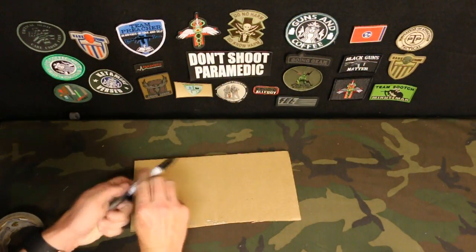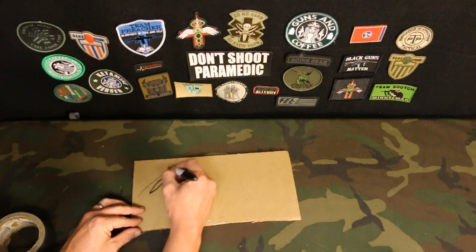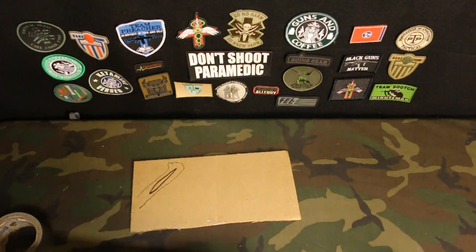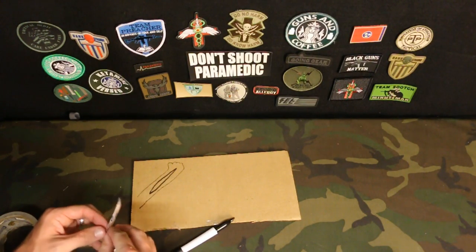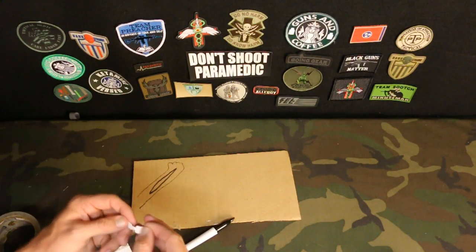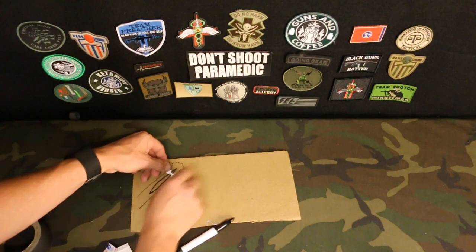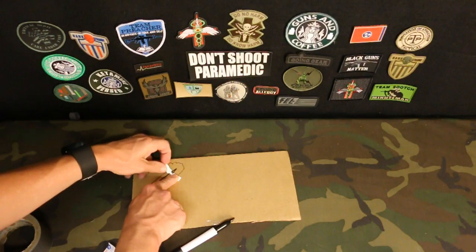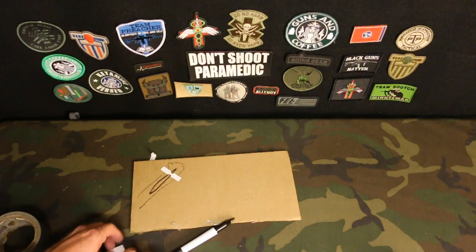Alright, so let's draw us another little cut here. I got a cut on my arm. Okay, it's a really big gash, but there's my arm. So we take the butterflies. We're going to open them up. And they're going to be sticky on one side. So what you can do is you put this one here, pull the skin as you're coming across, and pull this one off, and try to close this up the best you can as you're coming across.